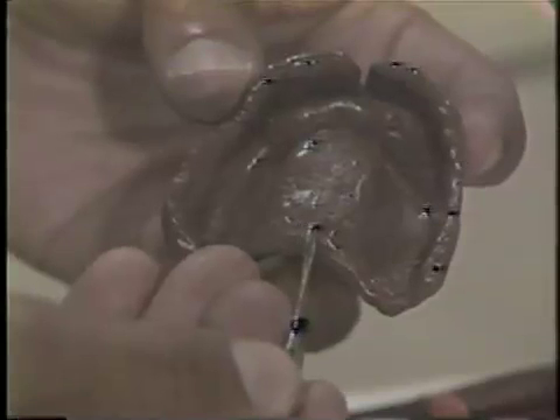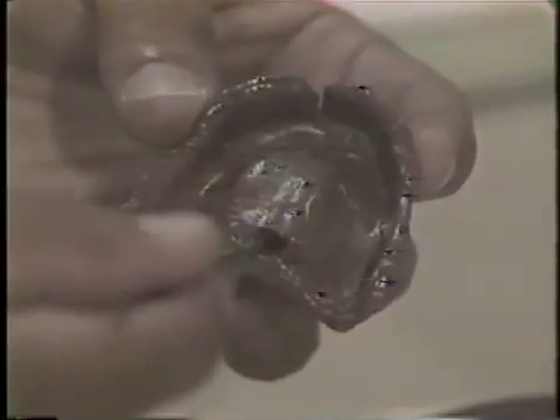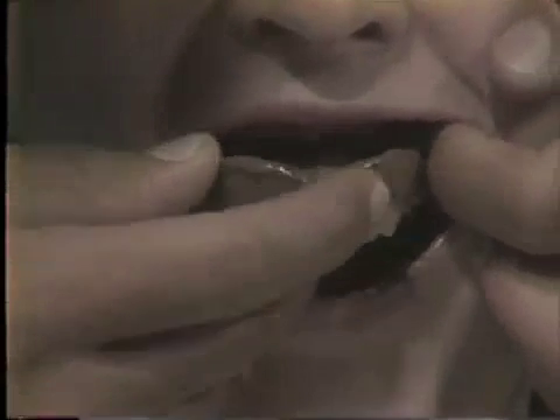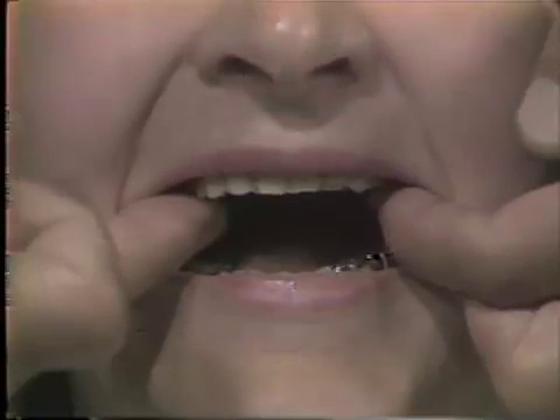The outline of the posterior palatal seal is now traced on the impression with a thin layer of sticky wax. Note that the posterior palatal seal usually includes the fovea palatinus, then extends laterally through the hamular notch. Once the thin layer of sticky wax has been outlined on the impression, it is covered with a layer of number four correcto wax. The impression is now placed back in the patient's mouth and held with slight pressure until the number four correcto wax has flowed. This should take approximately three to five minutes.